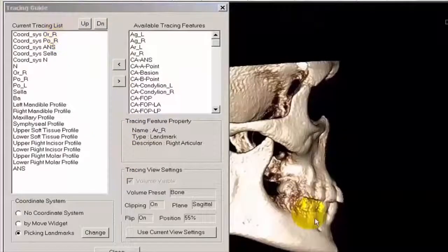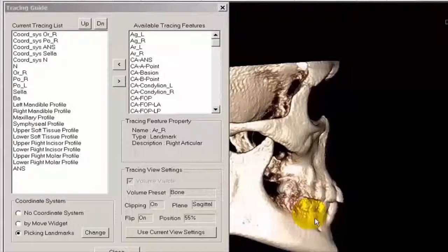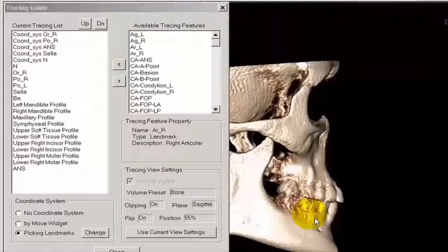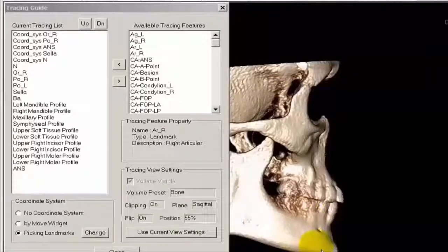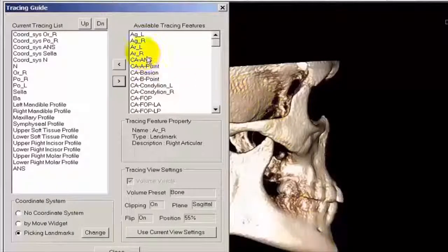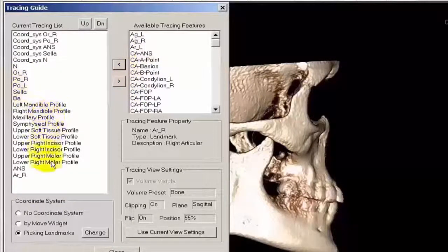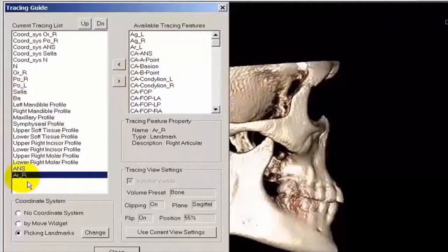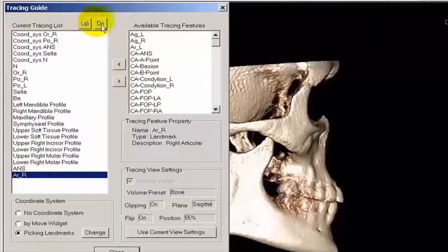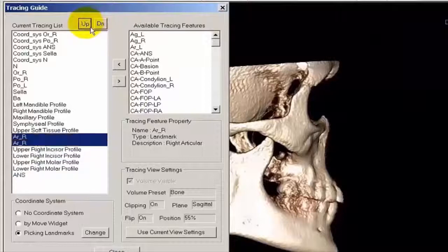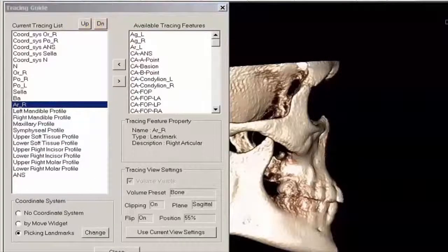The Articulary Right is the junction of the posterior ramus plane and the temporal bone of the skull. This landmark is not required when doing a Steiner analysis, which is presently the most common analysis used by orthodontists. However, you will need to mark the Articulary if you are doing a Ricketts analysis. For the purpose of showing this landmark, let's move Articulary back to the current tracing list by selecting it and clicking the left arrow, then use the up button to place it right underneath Basion, and click Close.